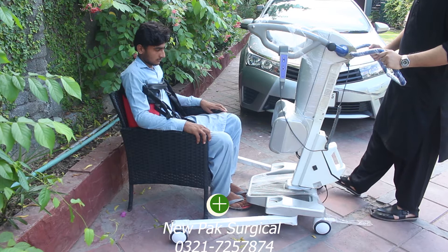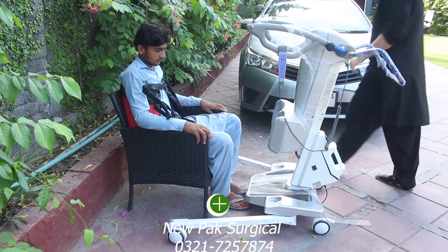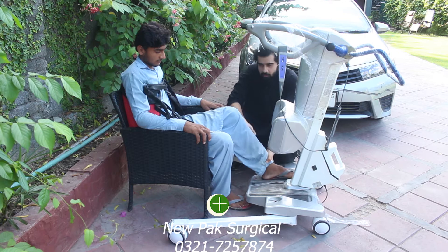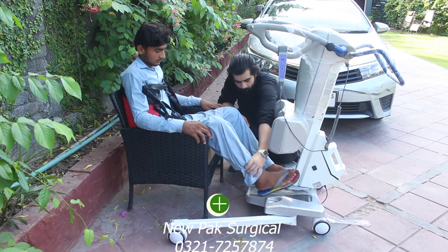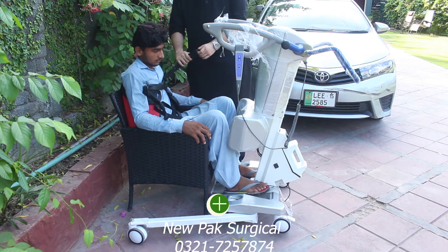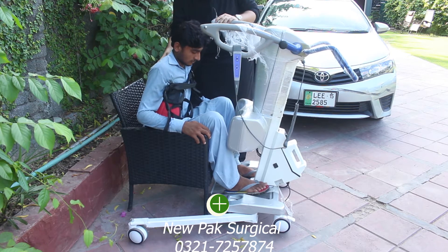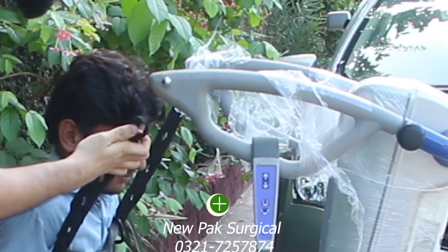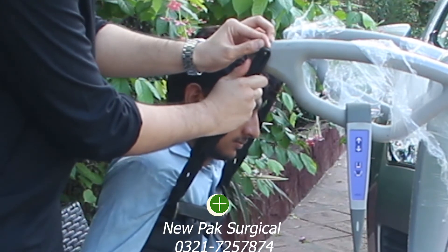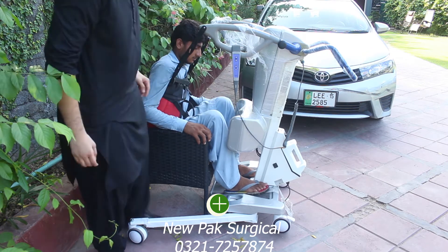Once we have set the lifter in position, we will lock the wheel so that the lifter is locked. After that, there is a foot placement where you will place the foot. You can push the lifter in. Then with the bands, you can lift the patient a little bit and close the band, locking the patient. This is the compartment where the patient's shins and knees will come.